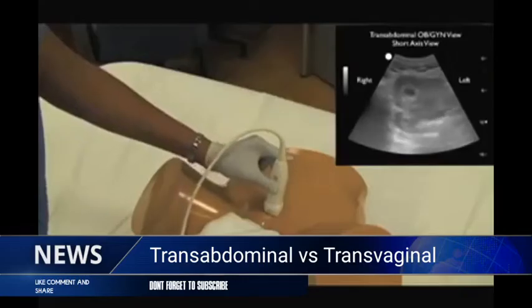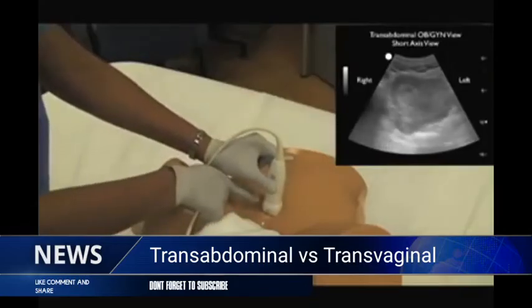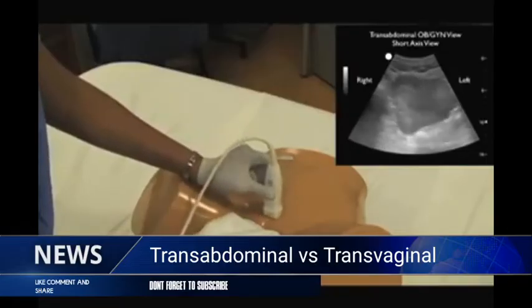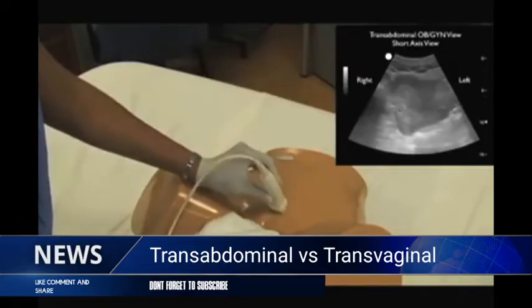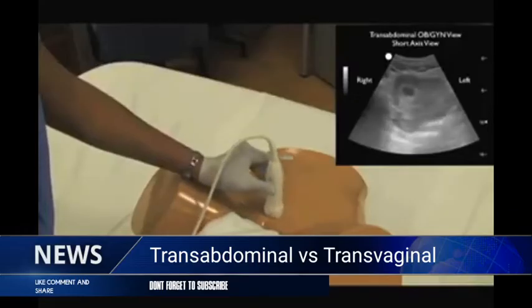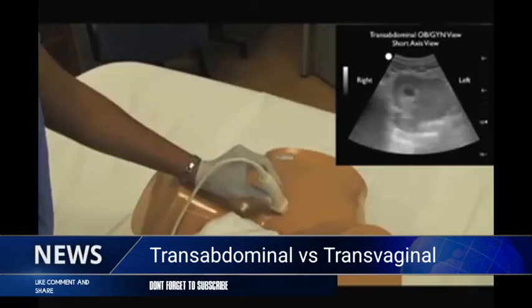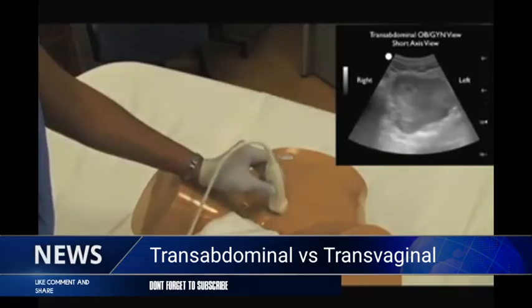Next, we're going to swivel the probe, so the probe marker is located over towards the patient's right side. So now the probe is sitting in a transverse or short axis orientation over the female pelvis. Notice here that we're swiveling the probe up and down, cutting through the female pelvis in the short axis orientation, and looking all the way from fundus down to cervix.